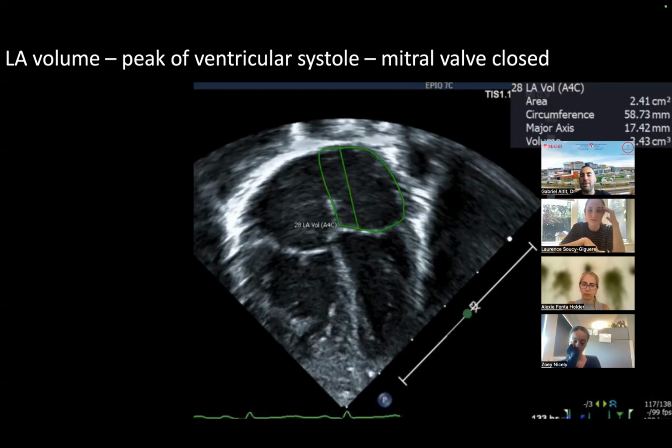So there's many reasons why babies could be underfilled: acute event, cord events, placental abruption, fetal maternal hemorrhages, things like this. So there's pulmonary venous return that will affect the LA size. There's obviously your interatrial shunt. So for example, if you have a really large hemodynamically significant PDA with very high QP:QS and very high pulmonary blood flow, a lot of systemic steal, well, you get tons of pulmonary venous return, and eventually this LA at some point will start to become a balloon and get really much filled.